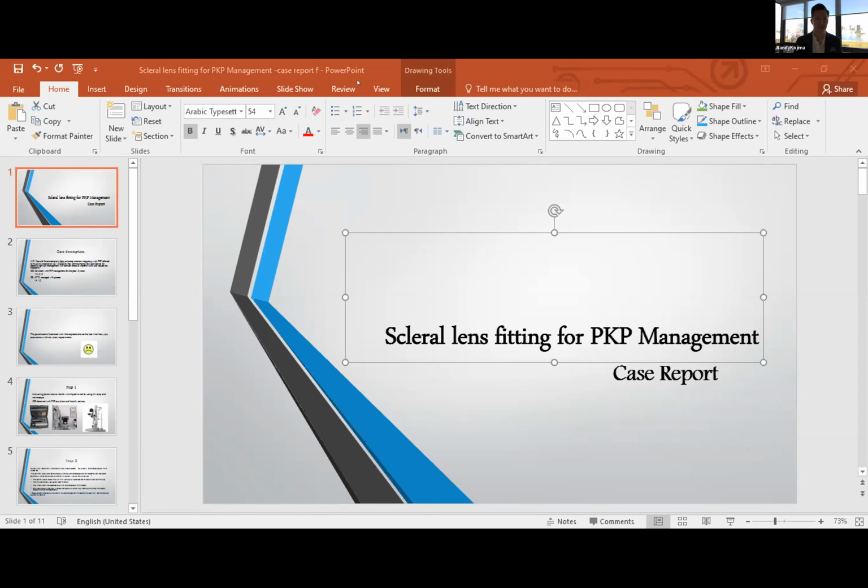I think just to add to that, the challenge that we face with scleral lenses, as far as contraindications, are transplants with a low endothelial cell count, because anything we put on the eye starves the eye of oxygen, and that would be the biggest concern that exists with scleral lens fitting.